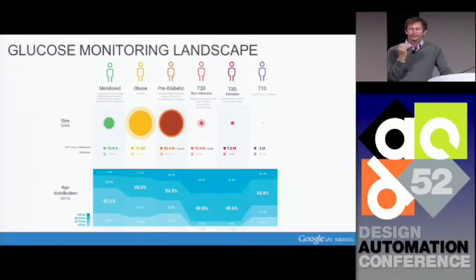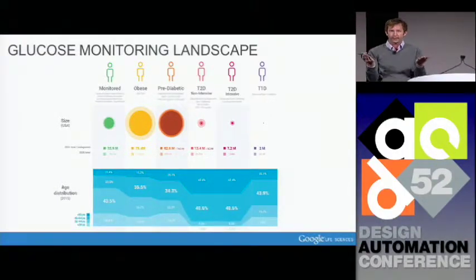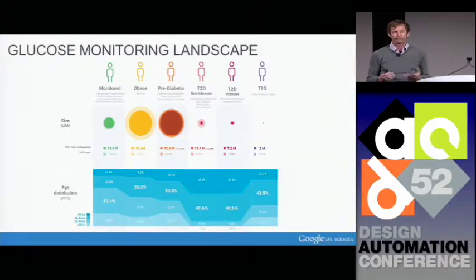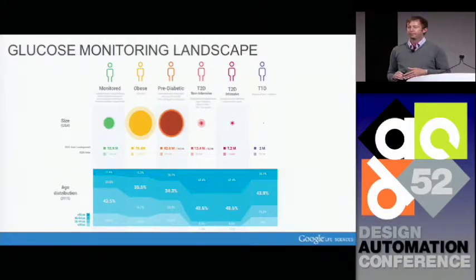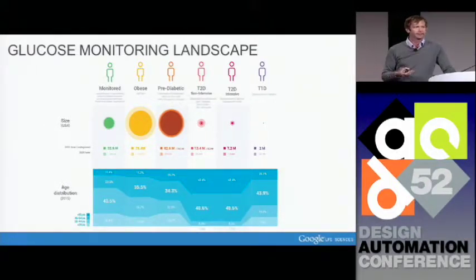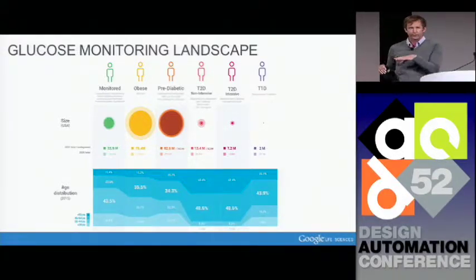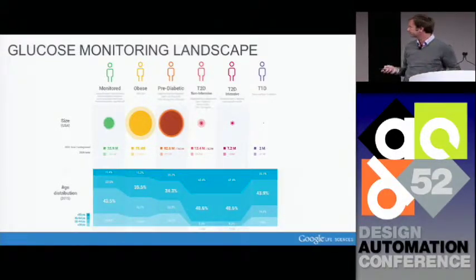And the reason for that, it's not that the rest of the people are being ignored, it's that the technology simply does not exist to give you a palatable way of measuring your blood glucose. In other words, if your life depends on having these four data points, you're going to prick your finger, you're going to wear this device, you don't care, you'll do whatever you need to do. But if instead you're thinking, this information may help me reduce my chances of becoming pre-diabetic in 10 years, you're not going to do it. The burden is way too high. So we need to introduce much more convenient ways of gaining access to this data.